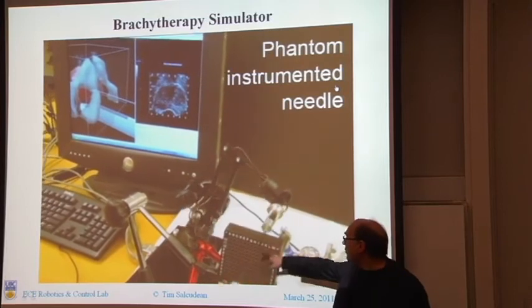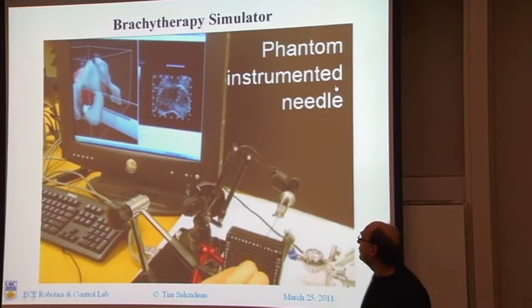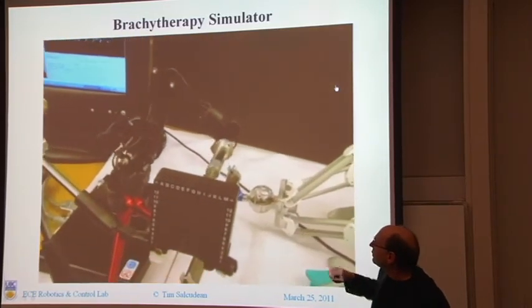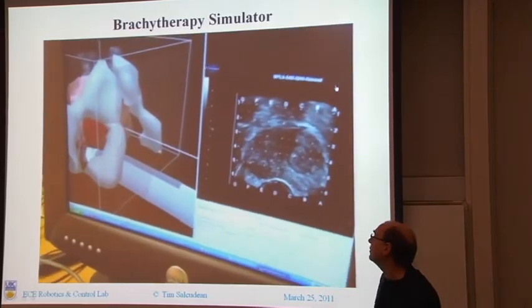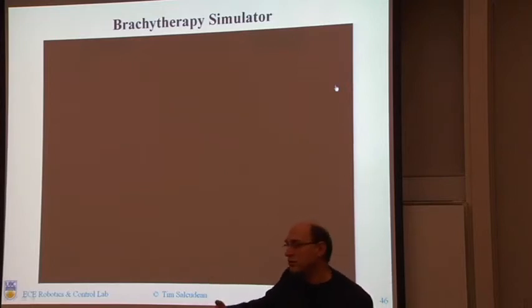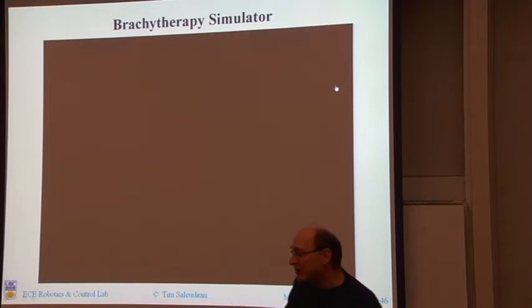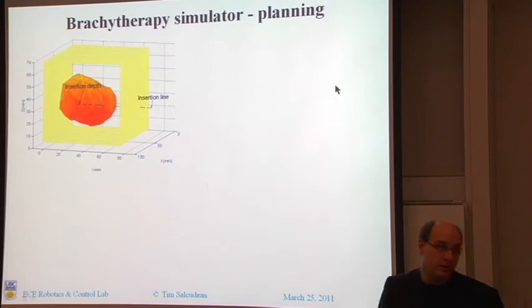So if you want to simulate the template needle insertion exactly as you do it in the procedure, then you can actually simulate both the rotation of the needle, which the physicians use to find the flickering of the needle bevel in the ultrasound image. And you can even reach behind the template the way they do it during surgery and push on the needle. The needle will deflect. Then the phantom will deflect relative to the template. That gives you actually the force that you apply on the needle.